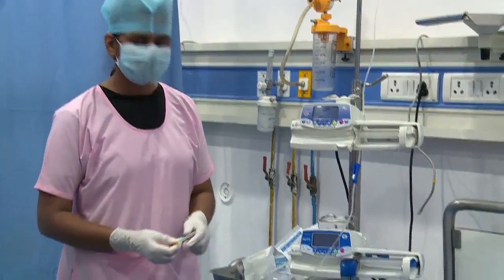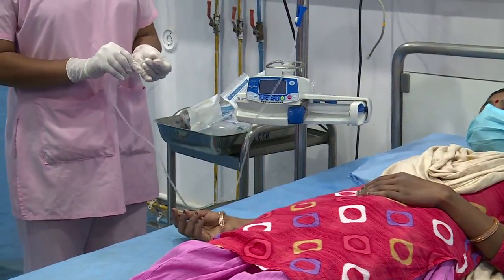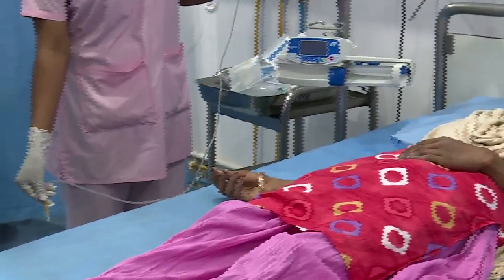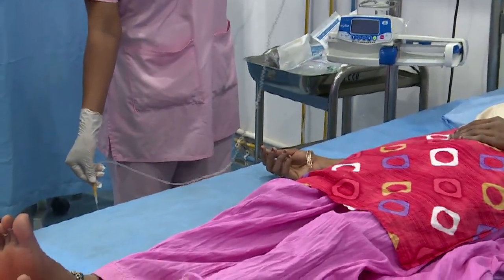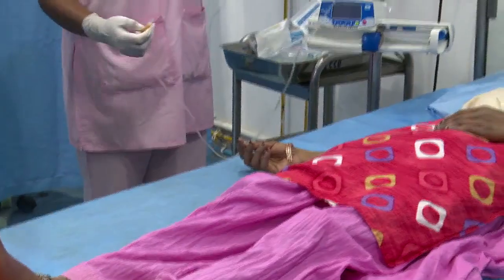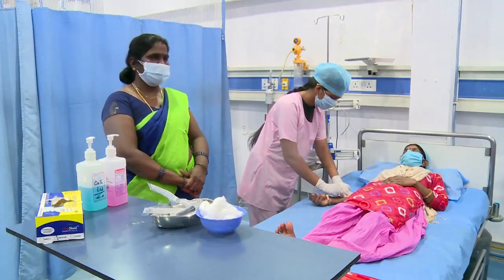Before connecting the tube, we have to check for any air inside the tube. If any air is there, we let the air out first. Then after letting the air out, we can connect the IV tube to the patient's IV cannula site.